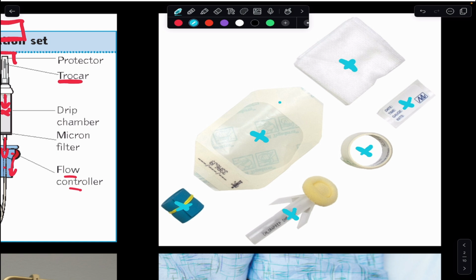How I would normally go about approaching this is making sure you're just set up for success from the beginning. So walk into the patient room, introduce yourself, go ahead and hang the fluid bag up, and make sure that you have easy access to the distal end of the tubing because you'll need that after you start the IV. Take your Tegaderm and peel off the paper on it and lay it with the sticky side up. That way you're ready to go.